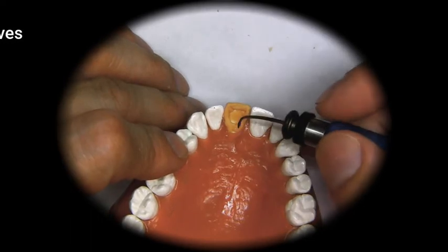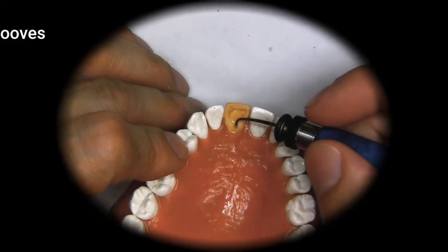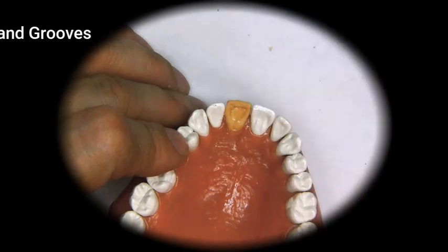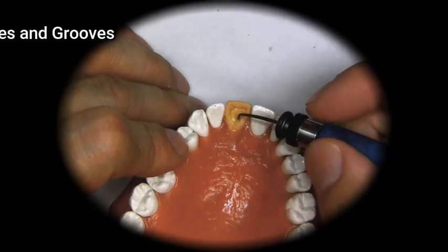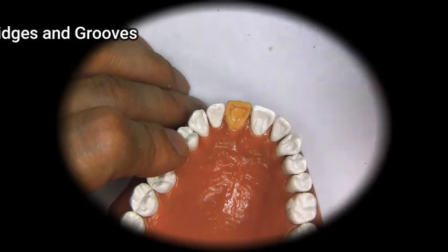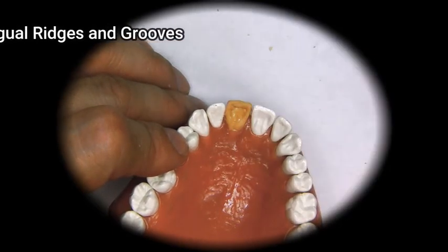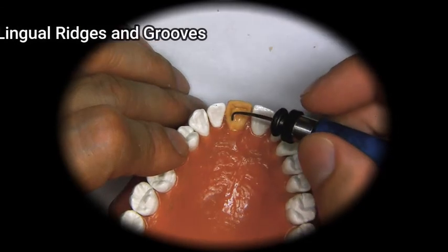So here we can add a couple of little ridges. Now this is completely optional. I like to add them because the other tooth has them also.